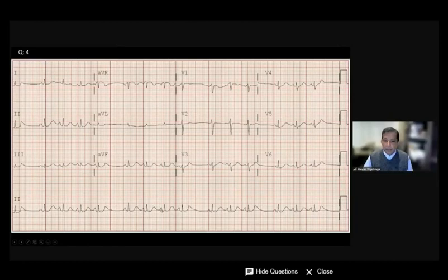It's regular. But if I have a P wave here hidden in the QRS, it comes much earlier, right? And when it comes in, that beat did not get conducted to the ventricle. And that's why you have a gap. So there are P waves there. And the key here is noticing it. Otherwise, you might consider that this could be sinus arrest. There is no P wave. There's a reason why there is no sinus P.